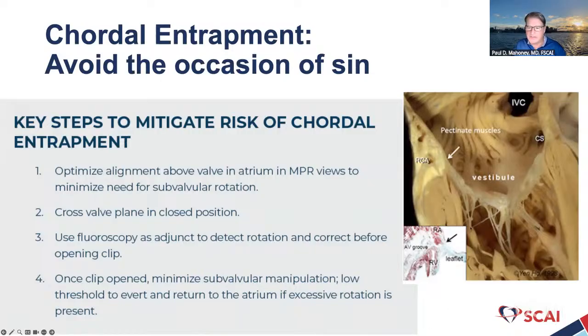You can see in the illustration here, the chords are very fine. And really in the tricuspid side, you don't have the same tactile feedback that a lot of us have come to rely on with the mitral plane, where you can get a little bit more feeling. Cross the valve plane in a closed position. Use fluoroscopy as an adjunct to detect rotation and correct before opening the clip. And once your clip is open, to minimize the subvalvular manipulation, have a low threshold to avert and return to the atrium if excessive rotation is present.